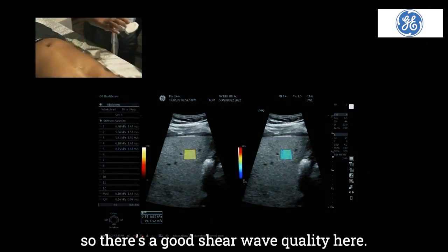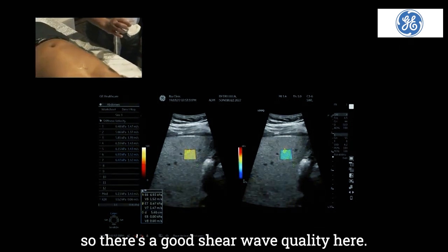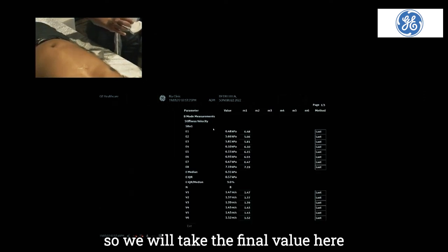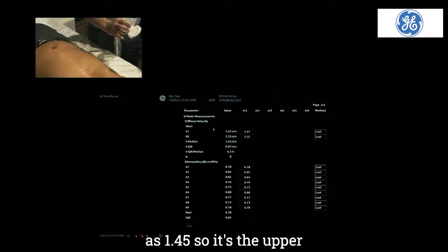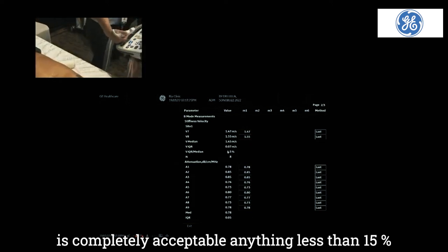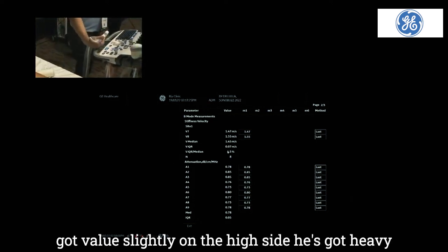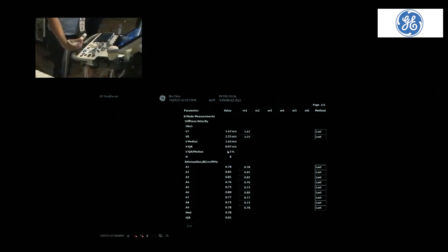So there's a good shear wave quality here. We will take the final value here as 1.45. So it's the upper limit of normal with a variation of 4.5%, which is completely acceptable. Anything less than 15% is an acceptable value for variation. So he's got values slightly on the high side. He's got heavy fat load with upper limit normal shear wave velocities.